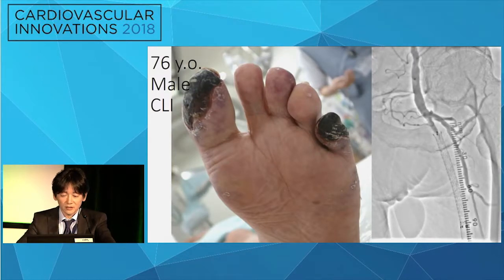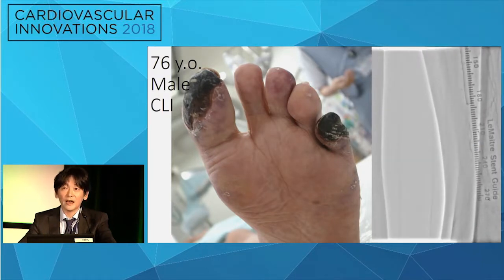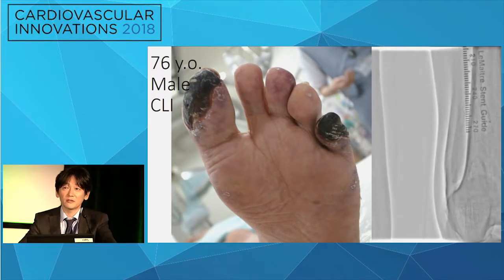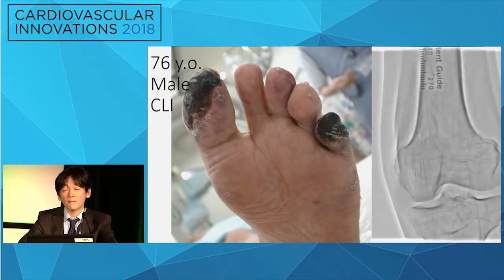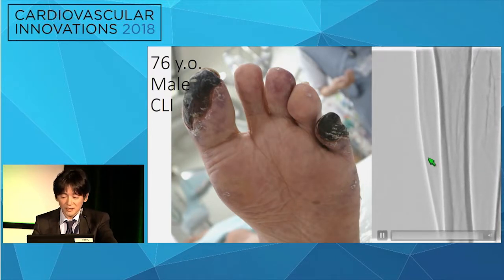Okay, let's move on to the next topic, the distal embolization. But actually, to be honest, I have few distal embolizations in tibial intervention. So we usually encounter the distal embolization during the iliac CTO or fem-pop CTO. Therefore, I will show you the case.